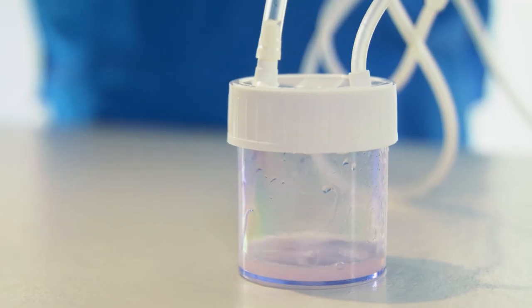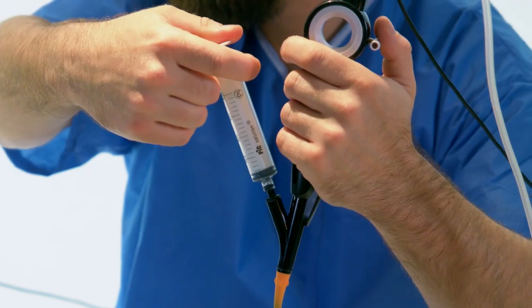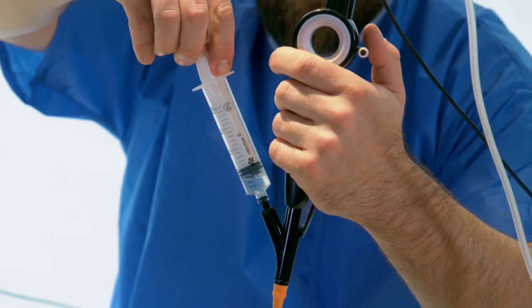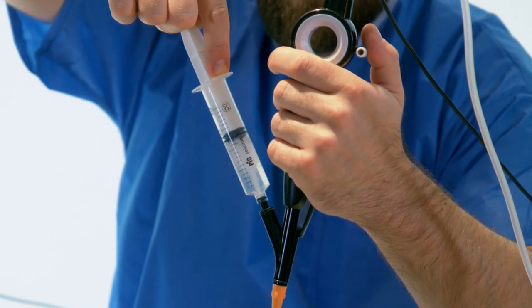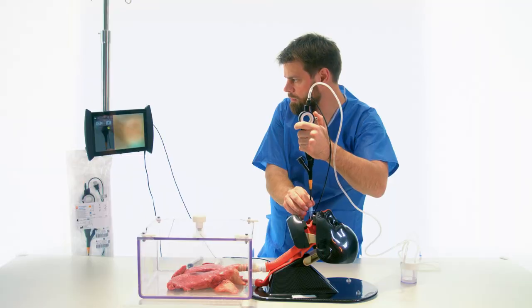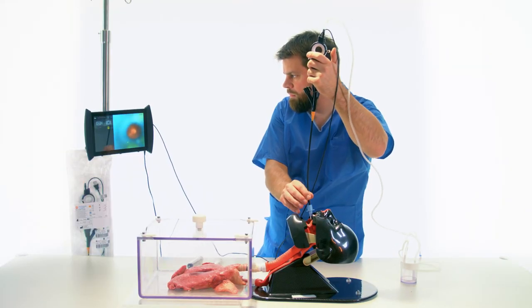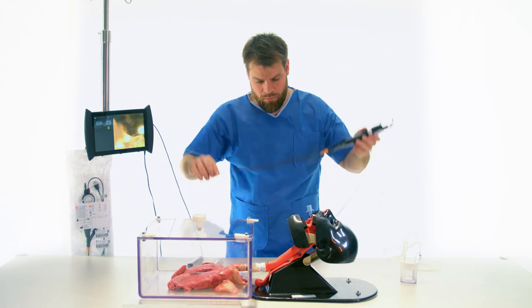The solution is recollected using the suction or with a syringe. The sample is sent to the lab for analysis. After the procedure, the bronchoscope is removed while taking care to release the bending.